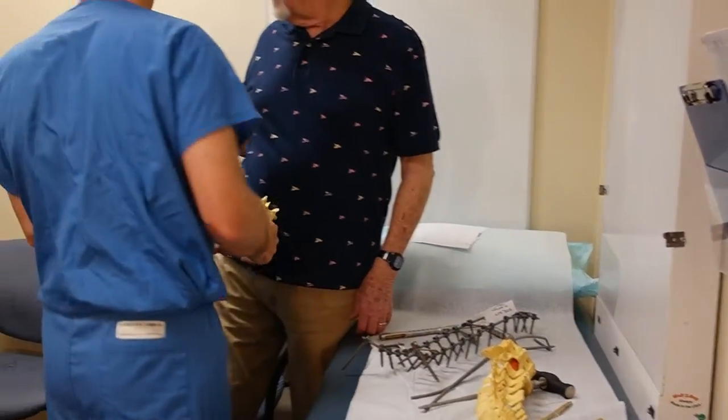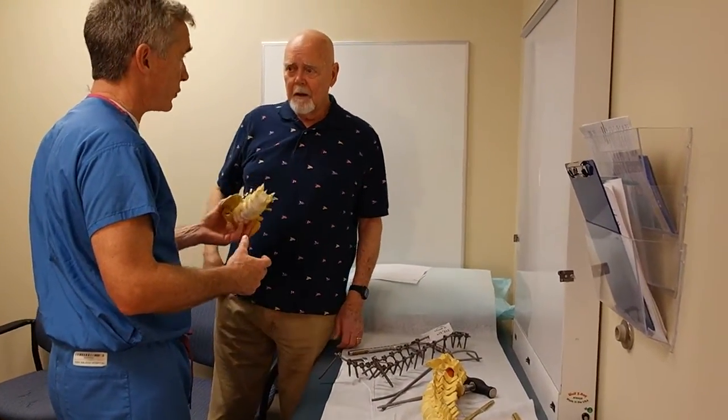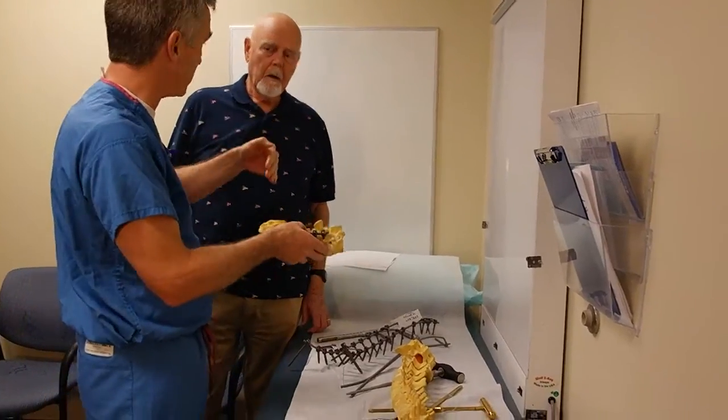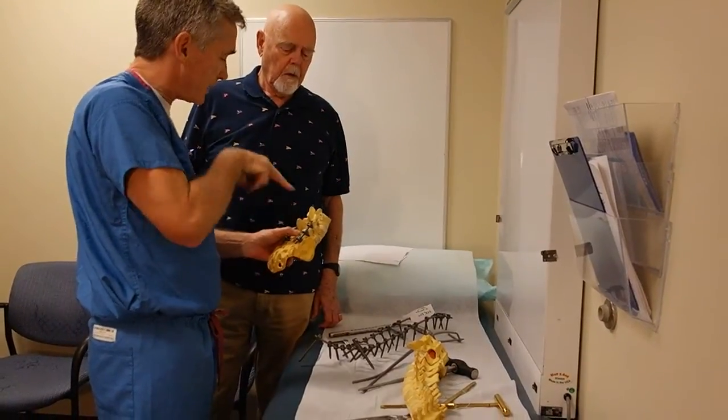A question I have is: some of those screws are off this way and off that way. That's right. If you have scoliosis, depending on the angle, they're going to be at different angles. There are some special ways that I calculate that angle and line it up to get it in the right place.